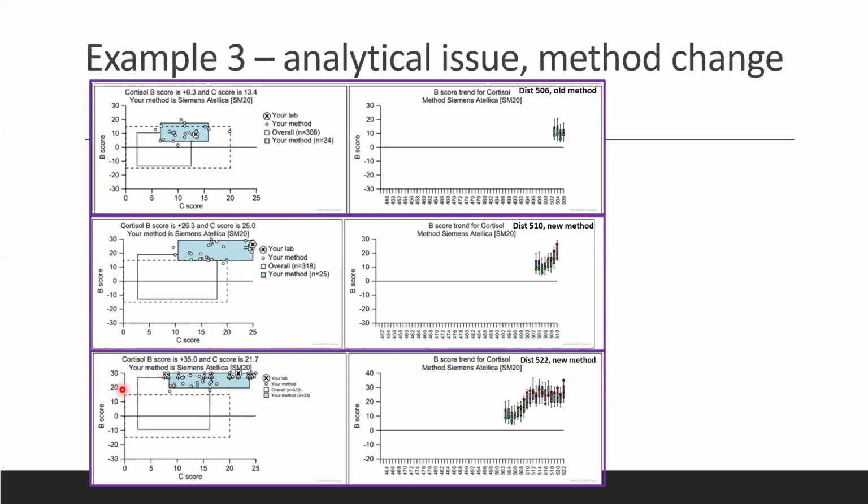Our in-house studies by the distribution of 522 have shown that there is also a difference in the level of bias between male and female samples, and we brought this to the attention of Siemens. And we've been reassured that the fix is being made and hopefully will be in place by April 2025.